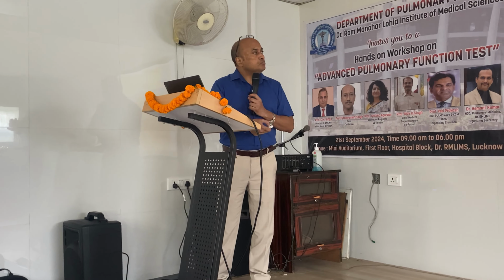To evaluate the obstructive airway diseases, to measure the airway resistance, when we breathe out or breathe in through tubes, then definitely flow creates a resistance. And to assess the bronchodilator response and hyperreactivity. All these are indications for the consideration of body plethysmography.